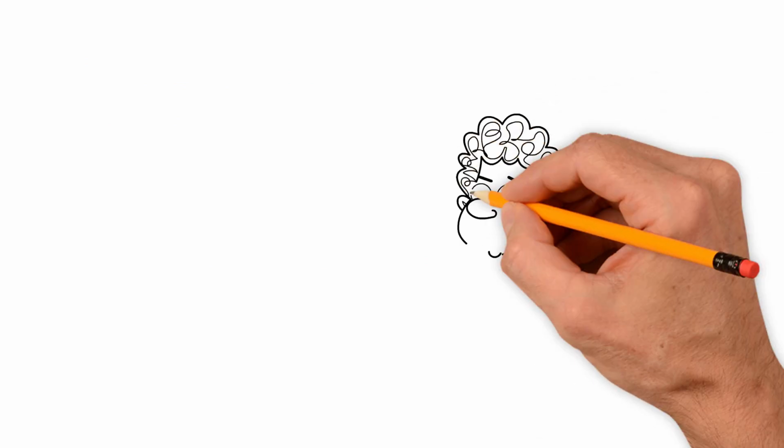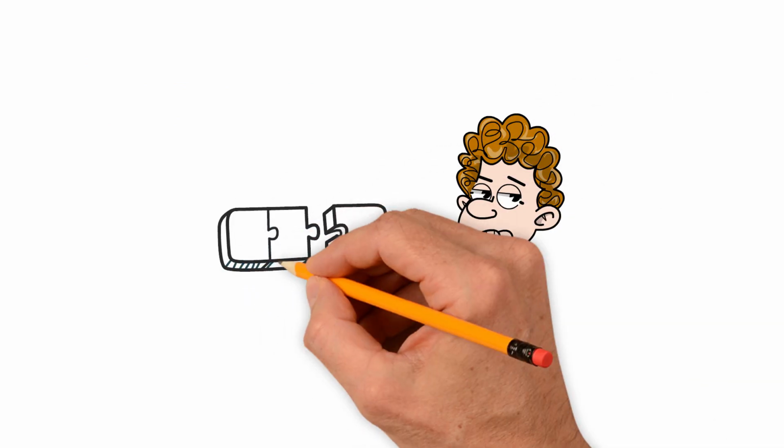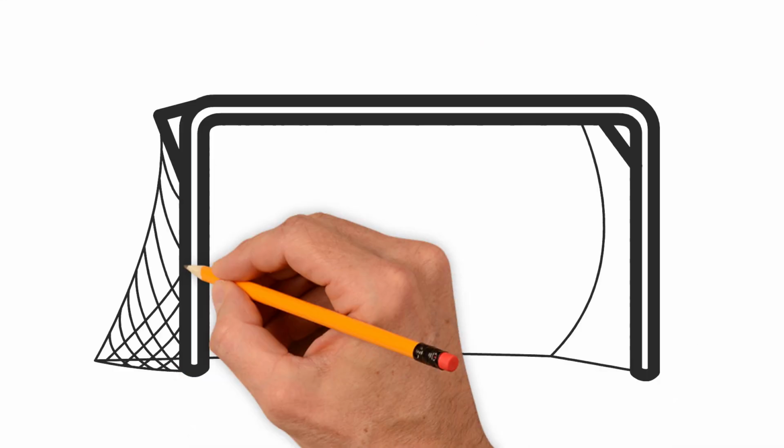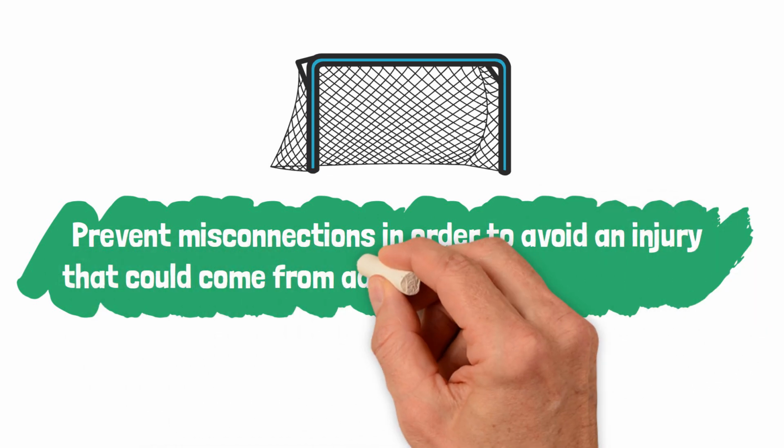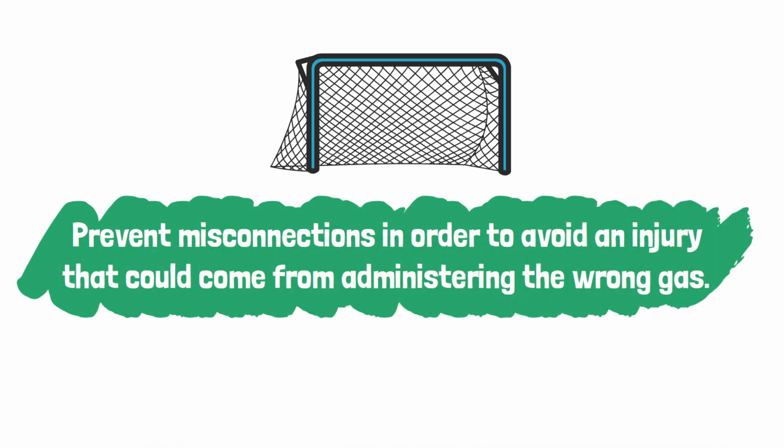I bet you're starting to recognize a pattern here. While each of the three systems are unique, the goal of each is to prevent misconnections in order to avoid an injury that could come from administering the wrong gas.